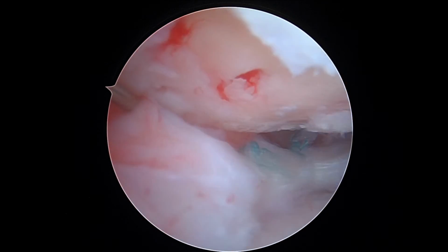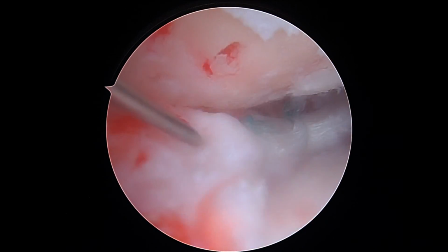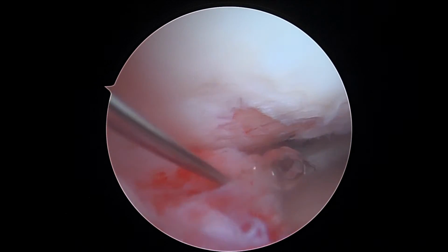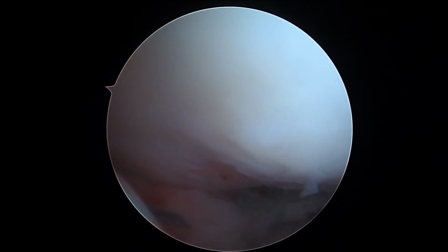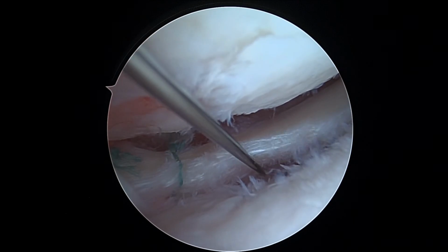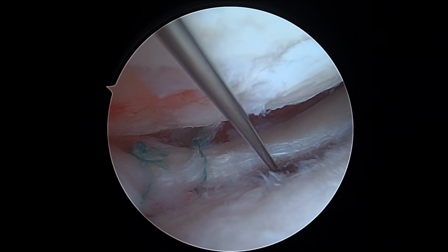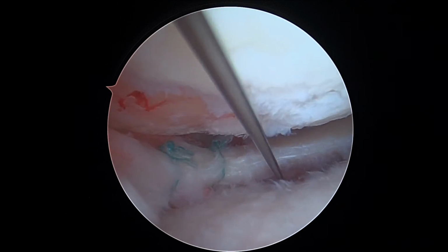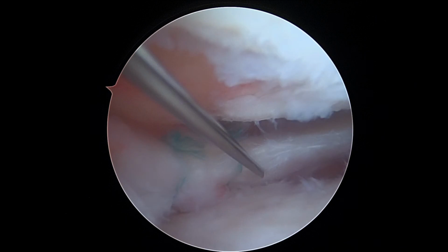We'll pull back a little bit. We don't want to do anything to disrupt the repair. The closest place I can get to capsule again is right about here. You can see how we're doing that right there. And now we're going to turn off the pump and finish up here.